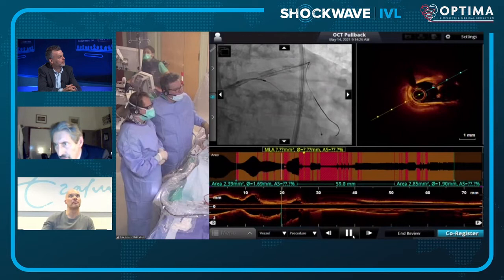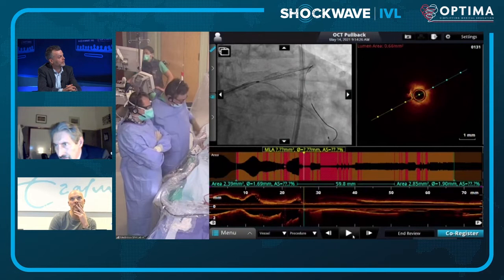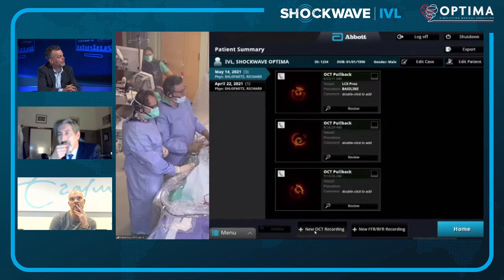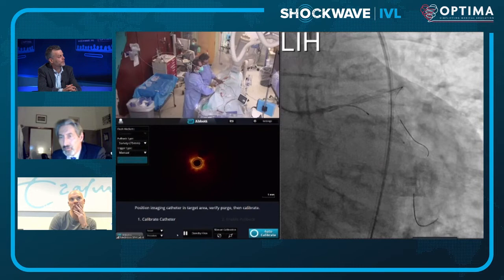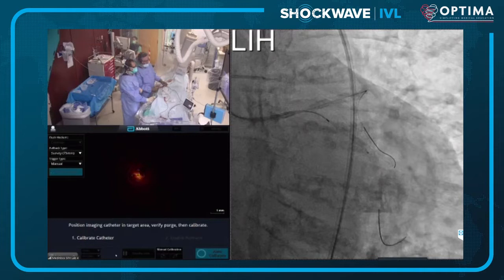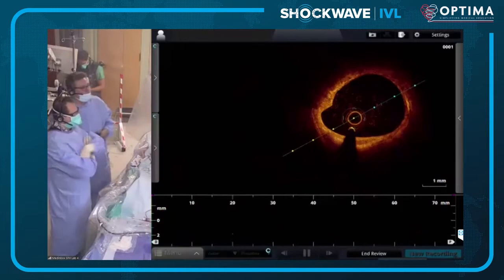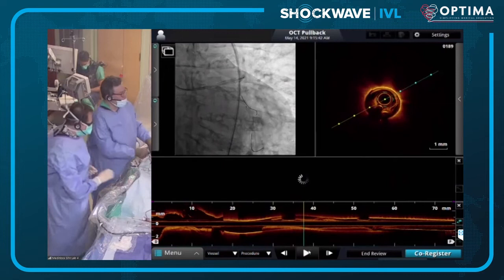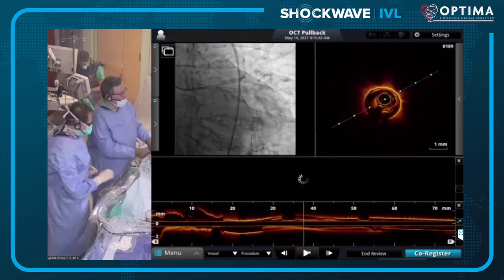Richard explains this was a saline OCT run — impressive for a large vessel like the circumflex. He'll do one more run proximally closer to the left main. For renal insufficiency patients he uses four cc's of contrast at the end just to confirm no perforation. The second saline run shows a little speckle within the lumen but spectacular image quality. For right coronary, circumflex, and LAD he usually needs two runs; saline OCT is used for anyone with renal insufficiency.